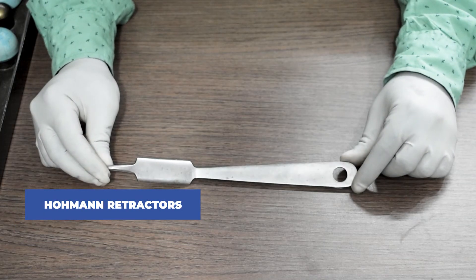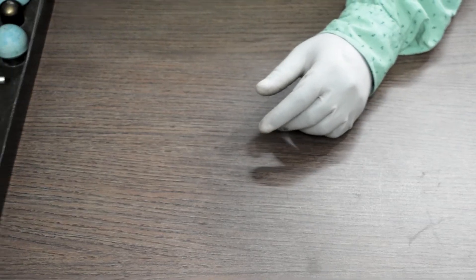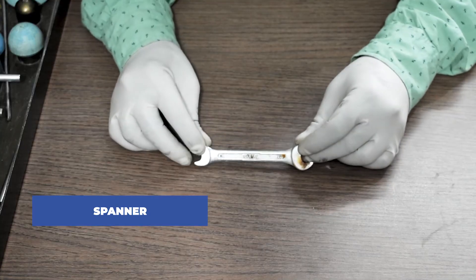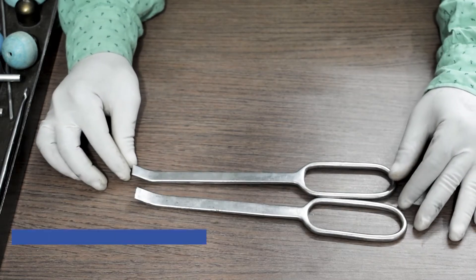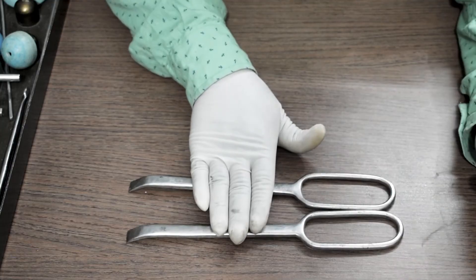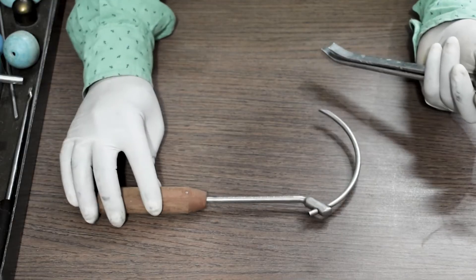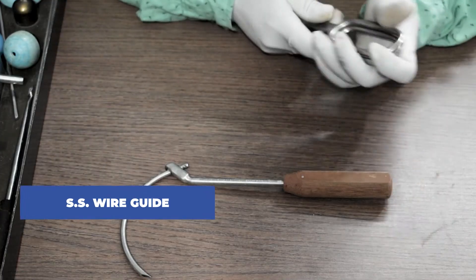This is a Hohmann retractor. Next, a spanner. These are called Bristow retractors. This one is called an SS wire guide — you can pass an SS wire through this guide.